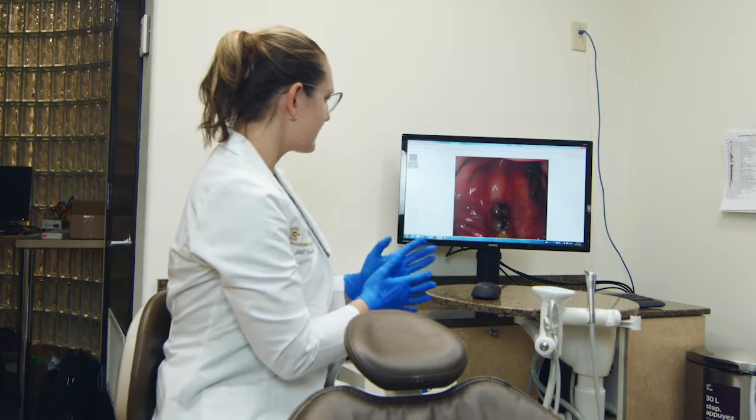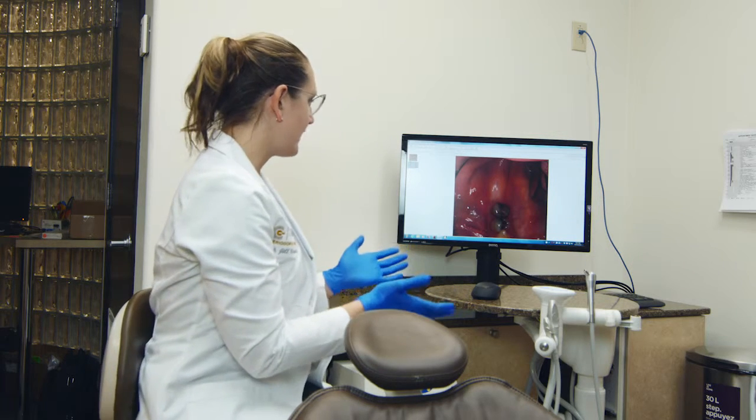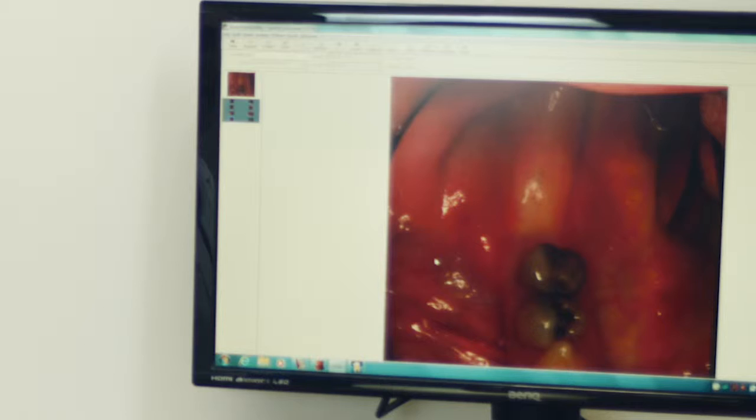So this is what the patient looked like intraoperatively. You can see that there is a narrow ridge in the first molar region, although we had some good keratinized tissue, which is an advantage. And so from a soft tissue perspective, it was a relatively simple case, but from a surgical perspective, there were some challenges in terms of the bone volume and quantity.